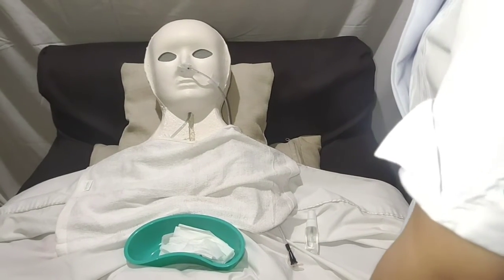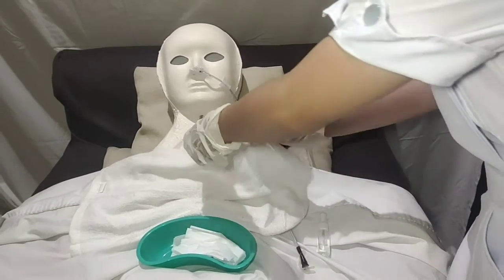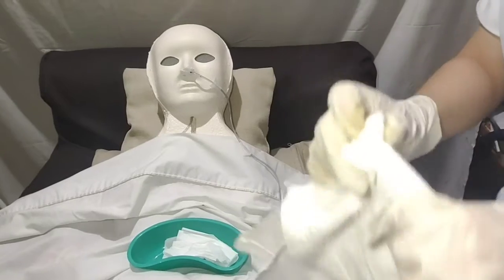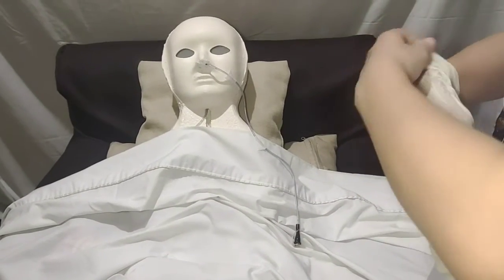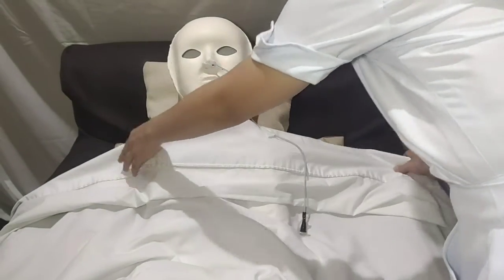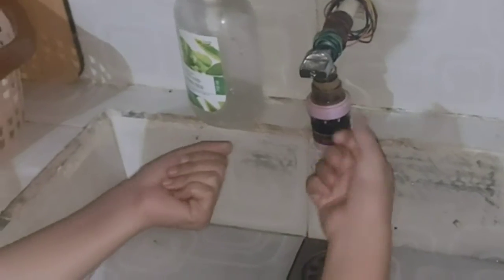Remove equipment and return patient to position of comfort. Remove gloves and raise head and lower bed. After the procedure, perform again hand hygiene. This is to prevent the spread of microorganisms from being contaminated.